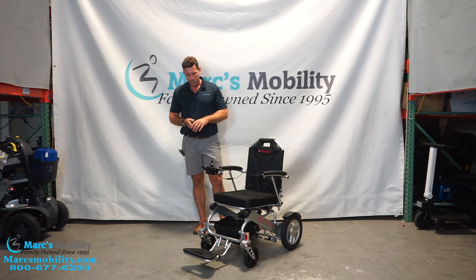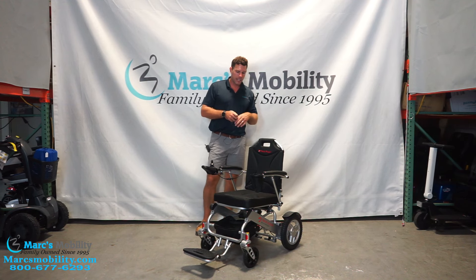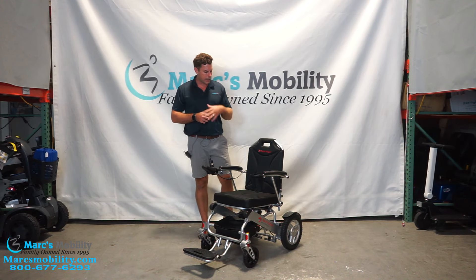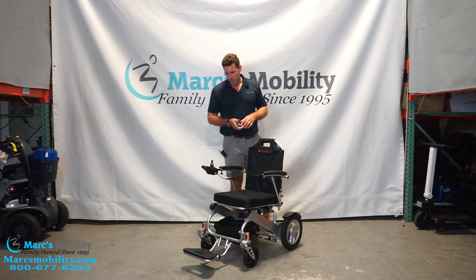This unit is fully approved for all types of transportation — cruises, planes, and trains. What really sets it apart from everything else is not just the weight capacity, but there are a few features I really like on this unit that are different from other things on the market.